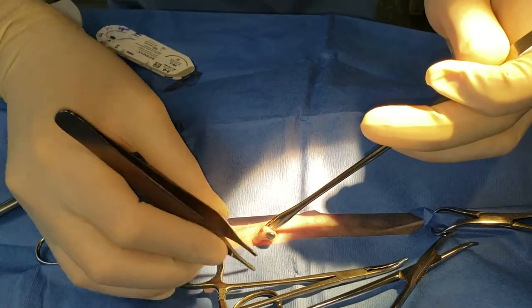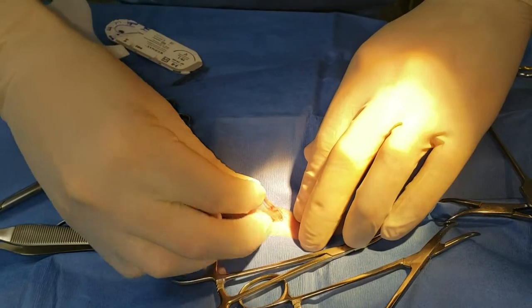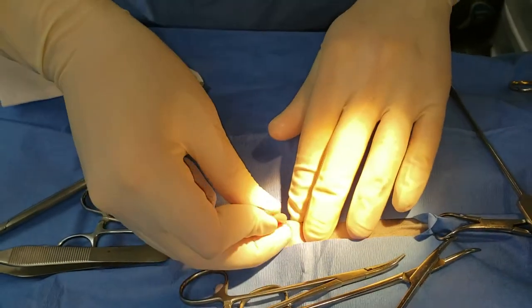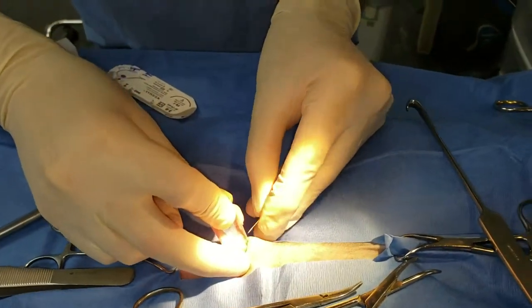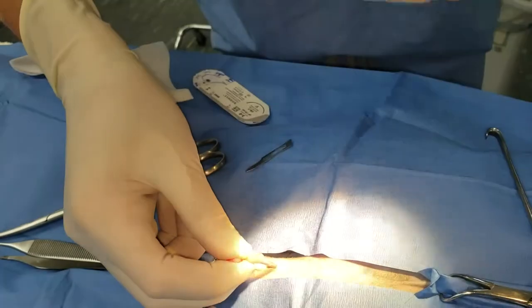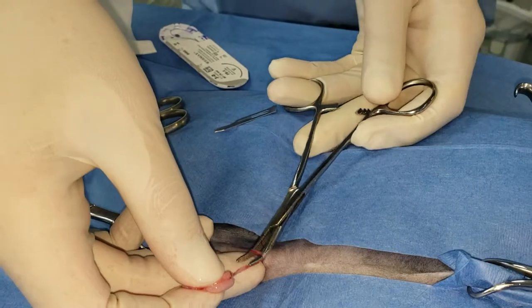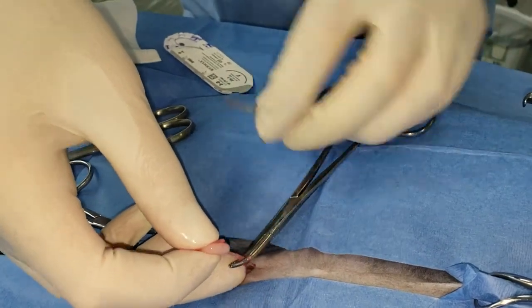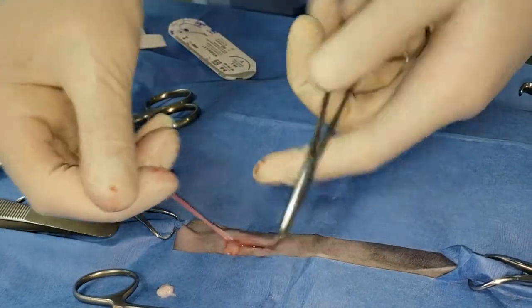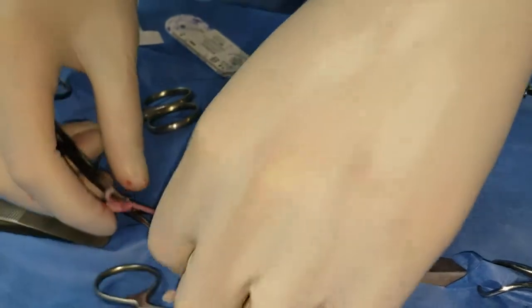And there it is. Basically this part — if you've seen that shelter med video — it's the same thing. I've got traction on the suspensory and push down the body wall. I cut the suspensory and then do my pedicle tie right here, then quickly cut and push the knot off, at the same time putting the actual horn between my fingers to stop blood flow. Then I clamp and pull caudally to get to the next horn and bring it up.